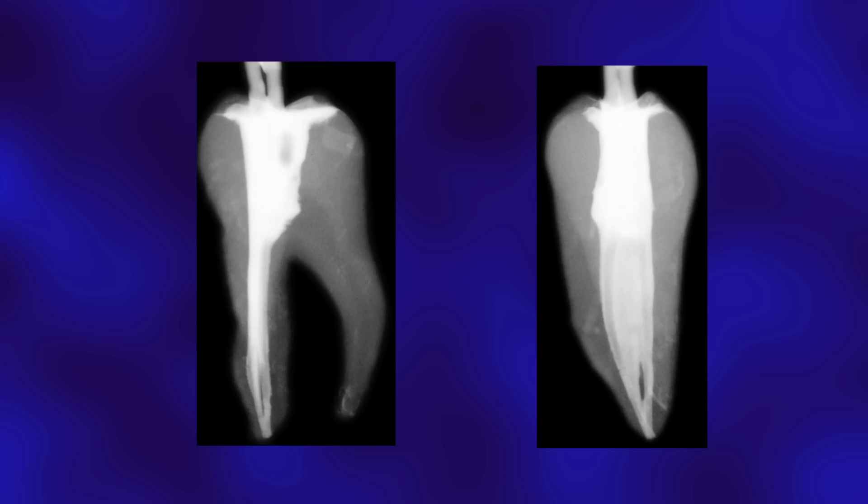Please note how we were able to fully shape and then obturate a highly oval isthmus-like anatomy. This is an impossible task with rotary NiTi — even if the instruments were able to extend their preparation to the buccal-lingual plane, they would be removing too much tooth structure in the mesiodistal plane. The combination of the safe-sider glide path through a 20 and the two Tango-Endo instruments accomplish this task while preserving dentin in the mesiodistal plane, producing what would have been thought of as incompatible goals: thorough cleansing and the preservation of tooth structure. The thinness of the root on its furcal side clearly tells us that conservation of tooth structure is a primary goal.